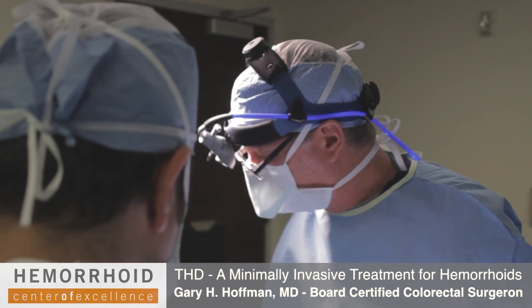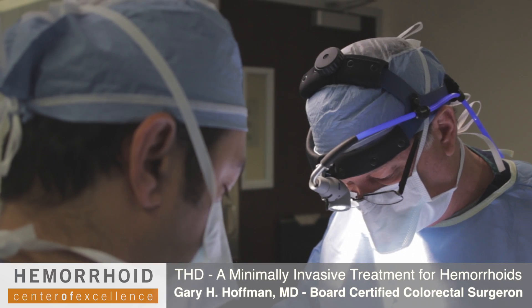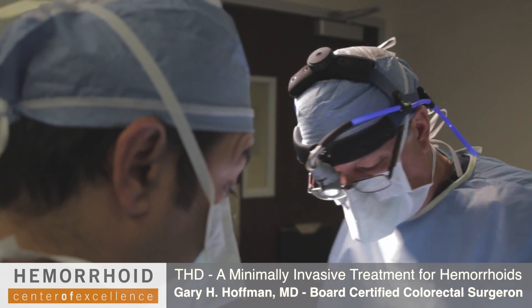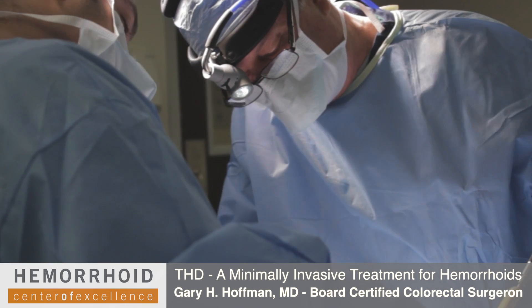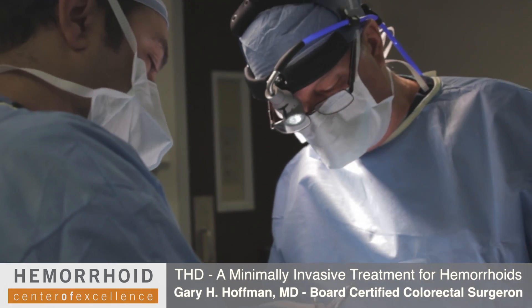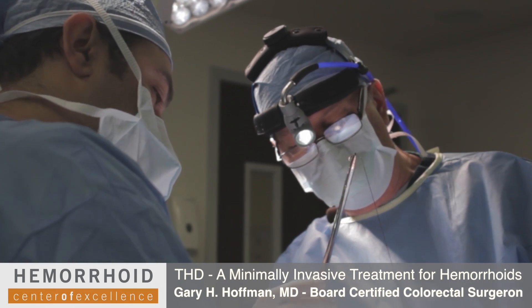It's always interesting that the room becomes very quiet after the blood has stopped flowing to the hemorrhoid, as opposed to the loud whooshing sound that you hear while the blood is flowing into the hemorrhoid. The theory behind this procedure is that the technology allows us to place our stitches in precise locations to simply occlude the blood flow without taking extra tissue.